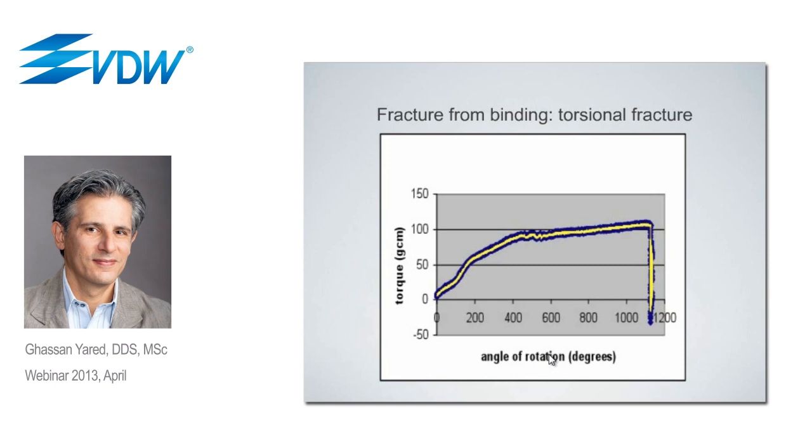On this graph, for this example, the instrument fractured at 100 gram centimeters. This is the torque at fracture of the instrument.